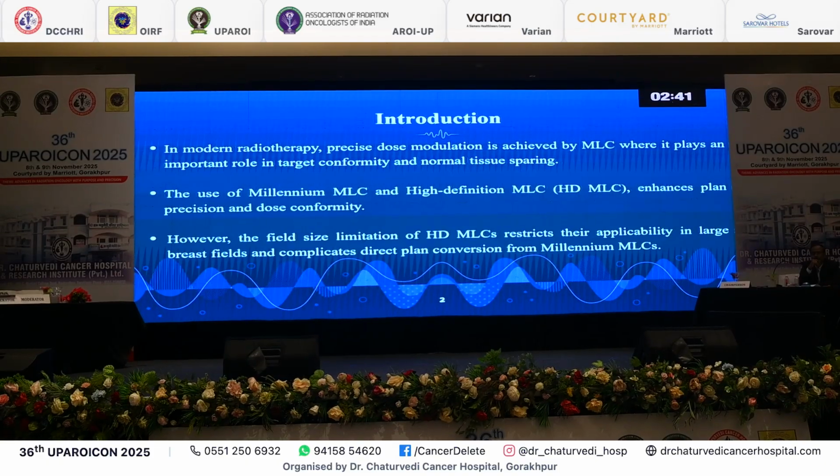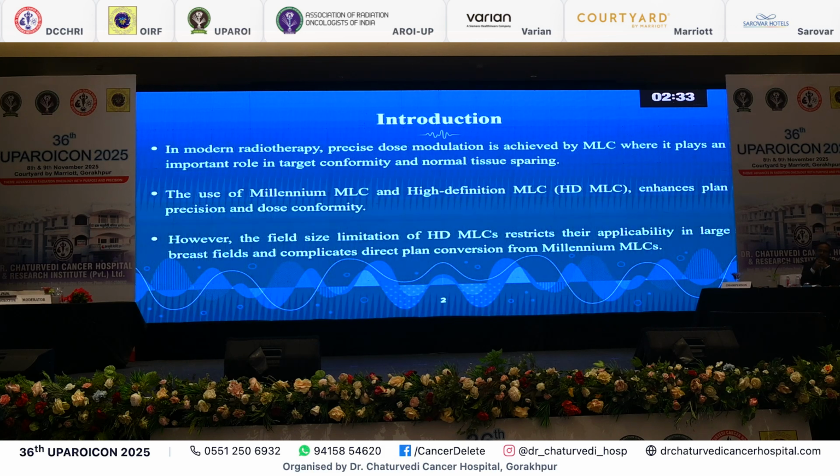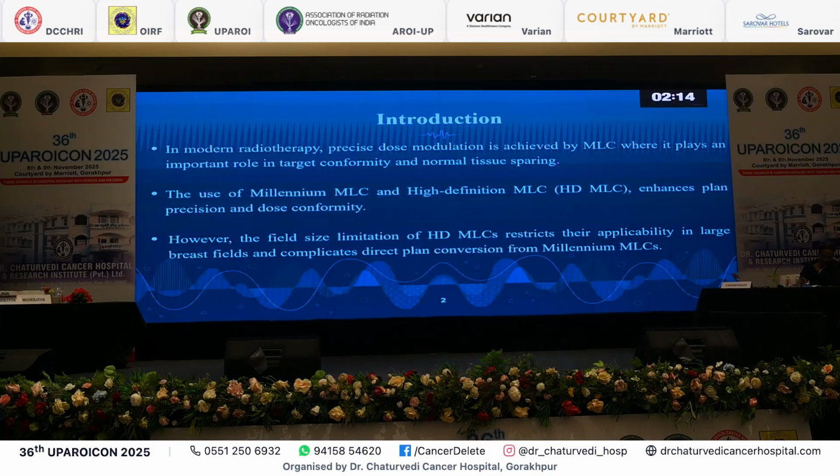I will start my presentation with a brief introduction. In modern radiotherapy, precise dose modulation is achieved by MLC, which plays an important role in target conformity and normal tissue sparing. The use of Millennium MLC and HDMLC enhances the plan quality greatly. However, the field size limitation of HDMLC restricts its applicability in breast fields, and it also complicates the direct plan conversion from Millennium MLC to HDMLC.